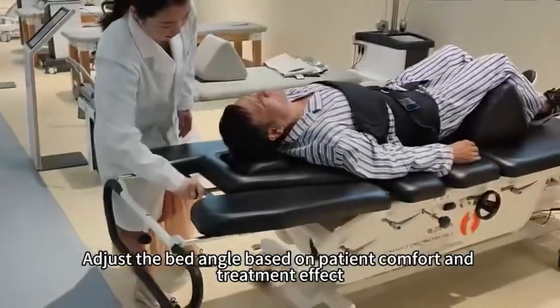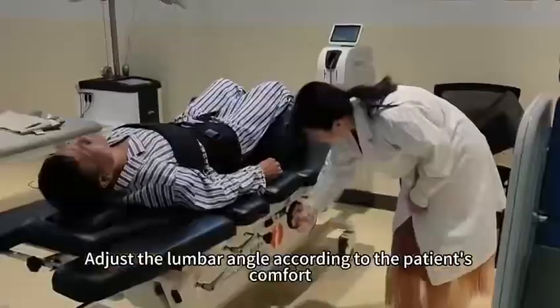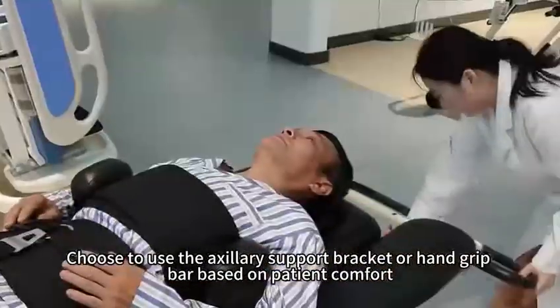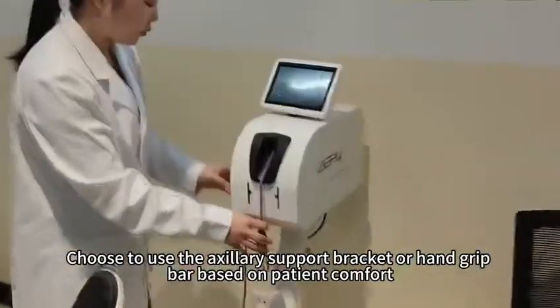Adjust the bed angle based on patient comfort and treatment effect. Adjust the lumbar angle according to the patient's comfort. Choose to use the axillary support bracket or hand grip bar based on patient comfort.